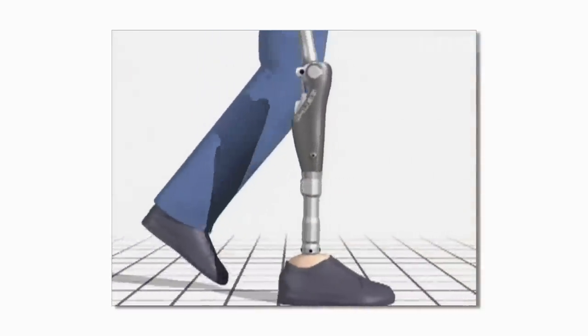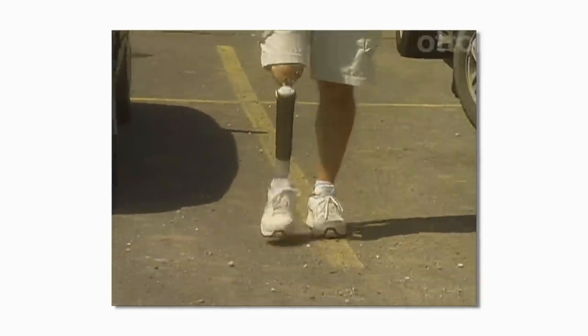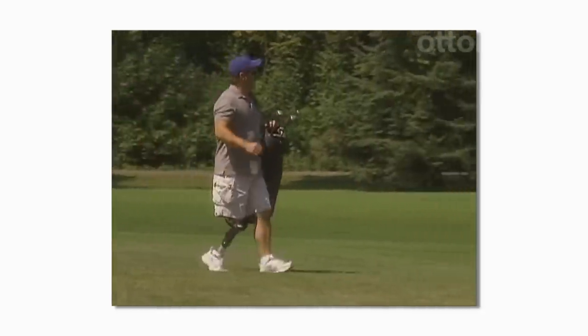If the knee joint senses that you are in an unstable position, it will resist flexing to help you maintain balance. The C-Leg uses sensors and a microprocessor to evaluate how much stability you need while walking. The knee can anticipate what the leg needs to do every step of the way, so it is proactive rather than reactive — a lot like the muscles in a sound limb.